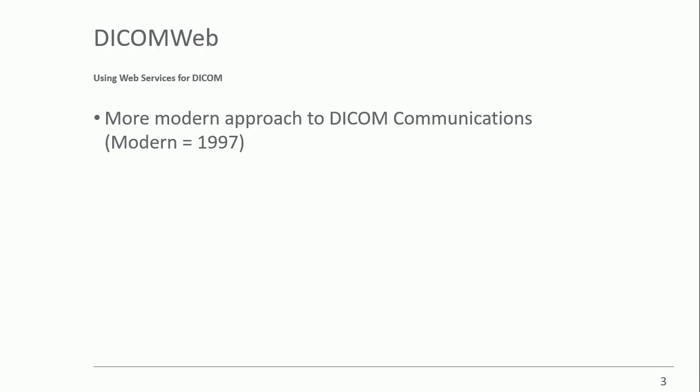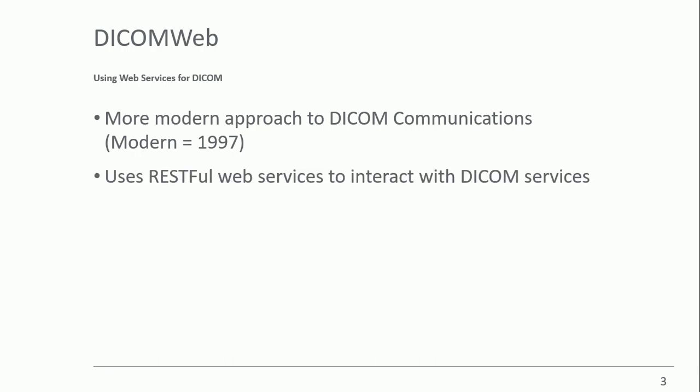Modern if you consider 1997 to be modern, because that's when all these standards for web services really started popping up, right? XML, SOAP and things like that, and REST. They all start to kind of crop up starting in 97 and going forward to today. So this stuff's been around for 20 years, but we're still kind of struggling to adopt DICOMweb. I think you'll find that by and large, as I'm recording this video, probably 90% of DICOM communication, maybe even more than 90%, is still everything I've talked about before. It's not really using DICOMweb yet.